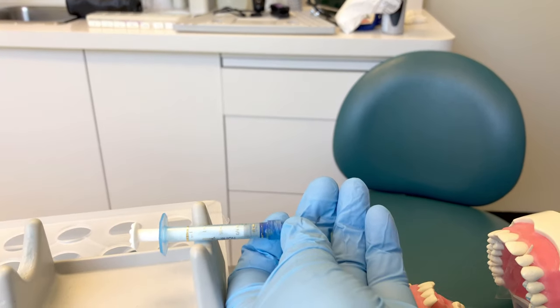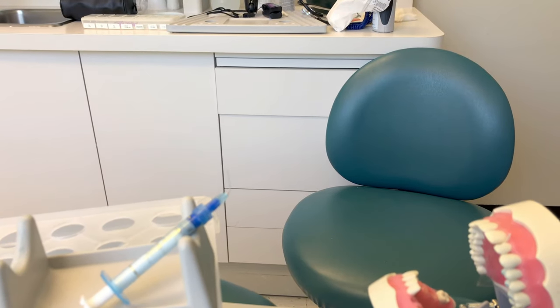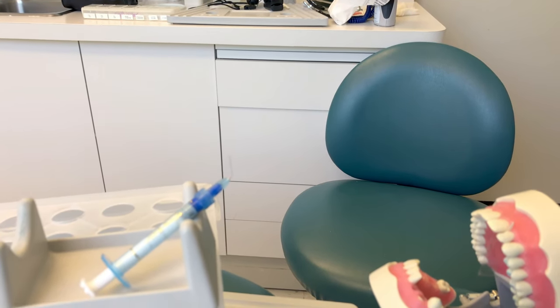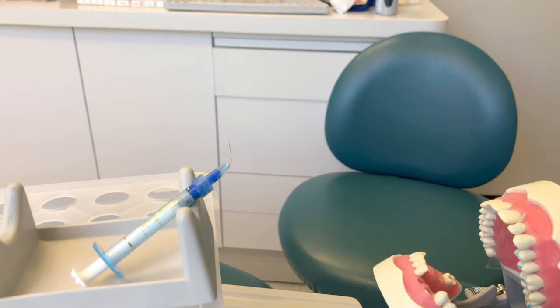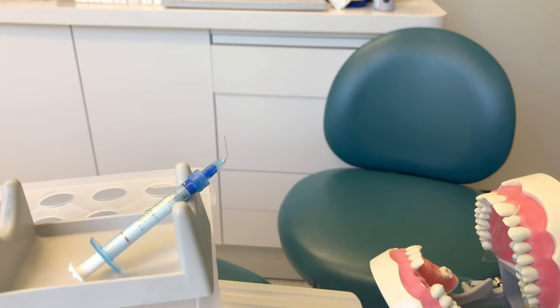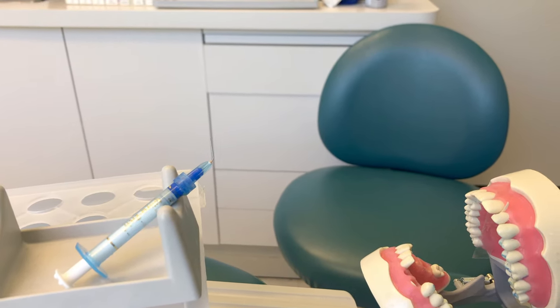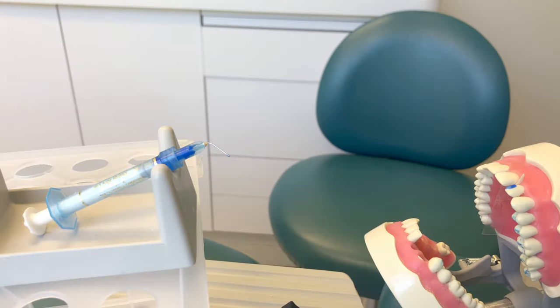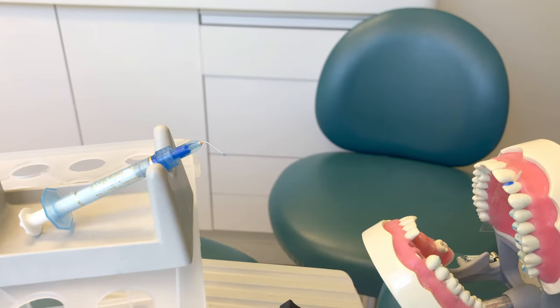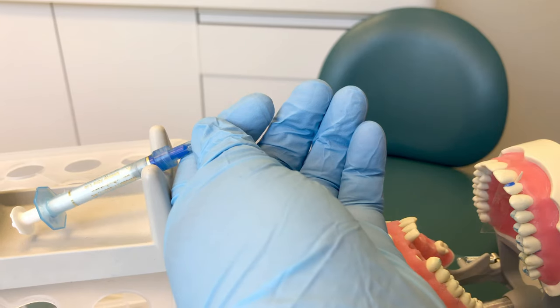When you pass the conditioner to your operator, hold the tip, direct it towards the tooth, and deliver it so the doctor can hold the plunger. The doctor will place the etchant on the tooth. In some states, doctors can delegate this duty to the assistant — check your state dental practice act, as it may be an expanded function.